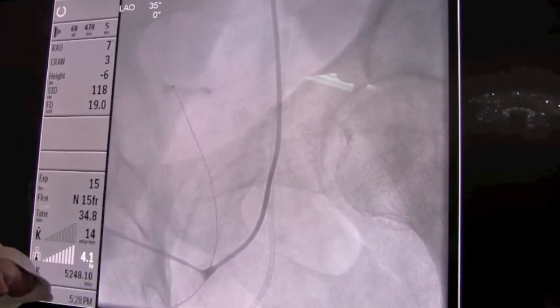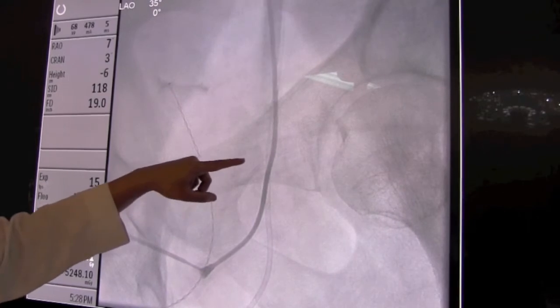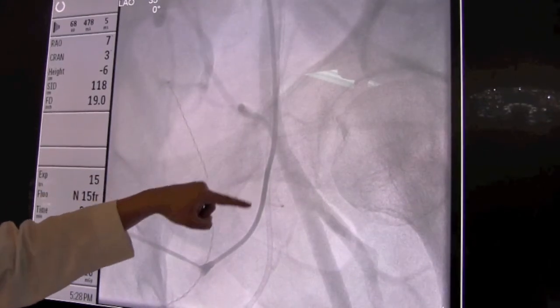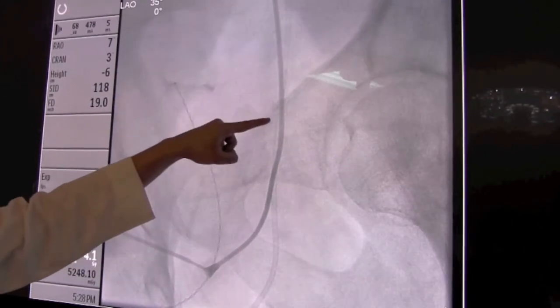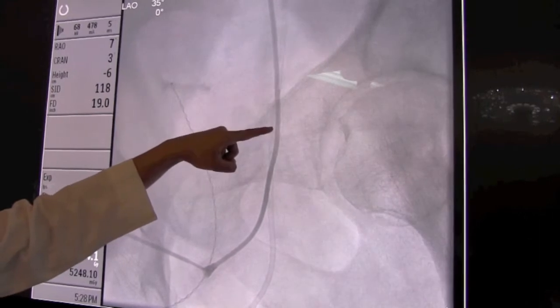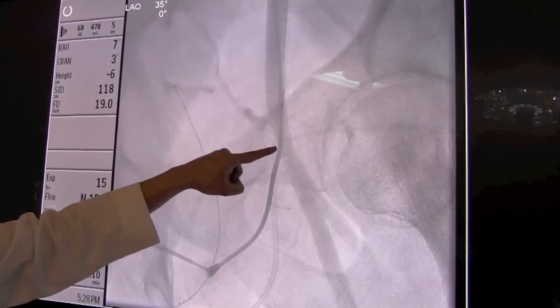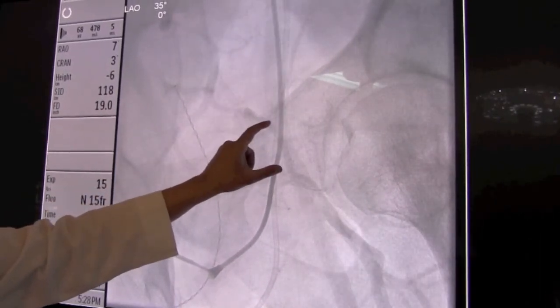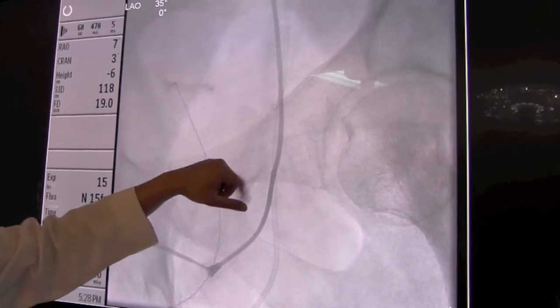Once we've accessed the artery in the place that we like, we take a picture through a small tube that we put in initially as a placeholder, so you can see that the tube is in a good position in a normal appearing part of this artery — not too high and not too low.